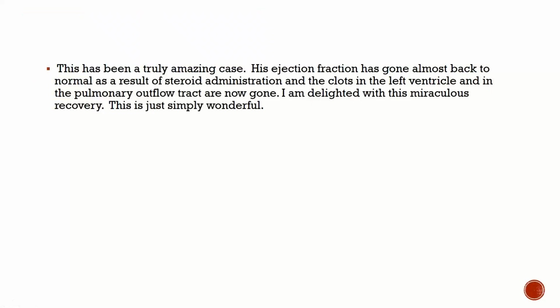So, in the words of the primary physician who was taking care of this patient, he said this has been a truly amazing case. His ejection fraction has gone almost back to normal as a result of steroid administration, and the clots in the left ventricle and the pulmonary outflow tract are now gone. I'm delighted with this miraculous recovery. This is just simply wonderful.